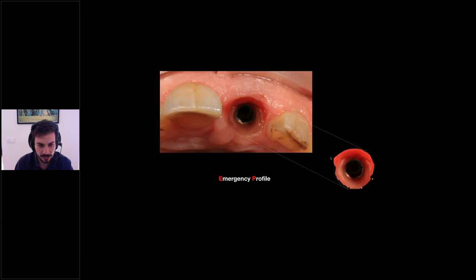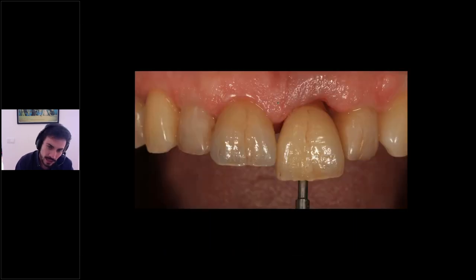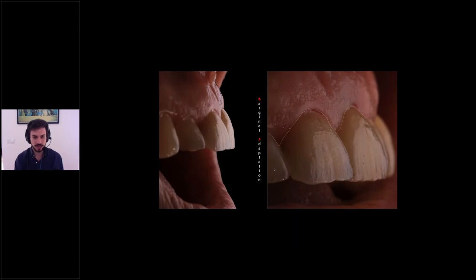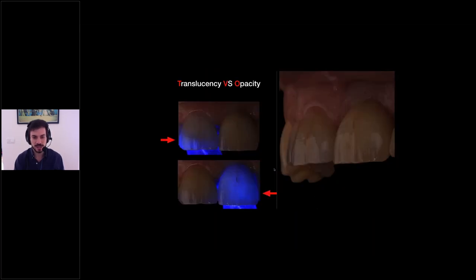and leave zirconium polished in the infragingival part of my restoration. This is the kind of emergence profile that we are able to get with all the volume maintained. And this is the final of the case with really cool integration of our restorations with the keratinized gingiva maintained in our patient, with a matching of color, texture and volume of our restorations. Really cool integration and a really happy patient with this treatment, whole patient, one surgery and this result.